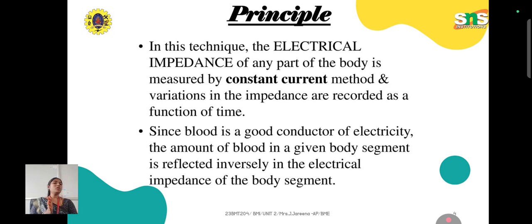If you have 5 volt, then for 5 volt what is the change in resistance, because we know the constant current. The output we get is some voltage drop, either 5 volt or 6 volt or so. Now you know the constant current value and the voltage value. When you substitute these two, you come to know your resistance value, that is our area of interest. Now the next part is how this change in resistance interlinks with your blood flow, how these two technically different components are interlinked.